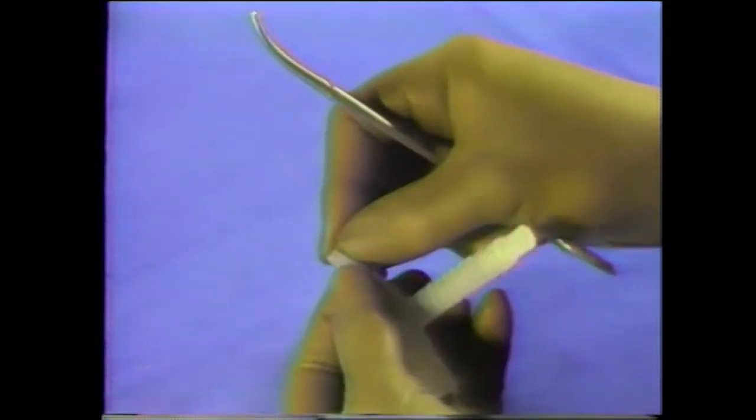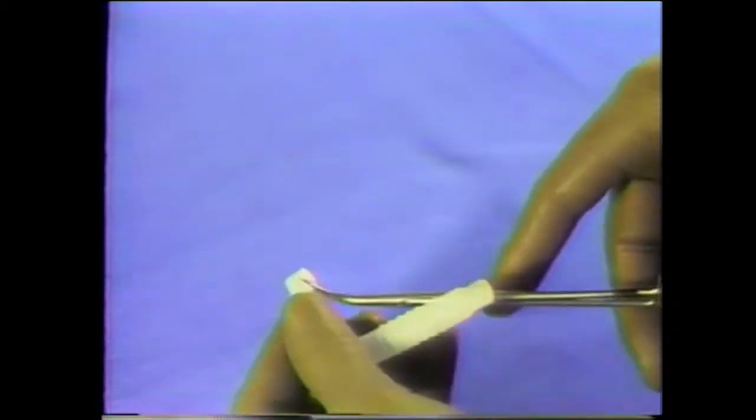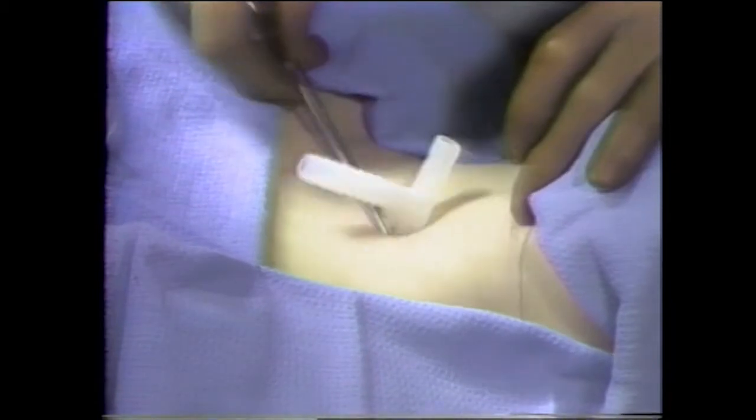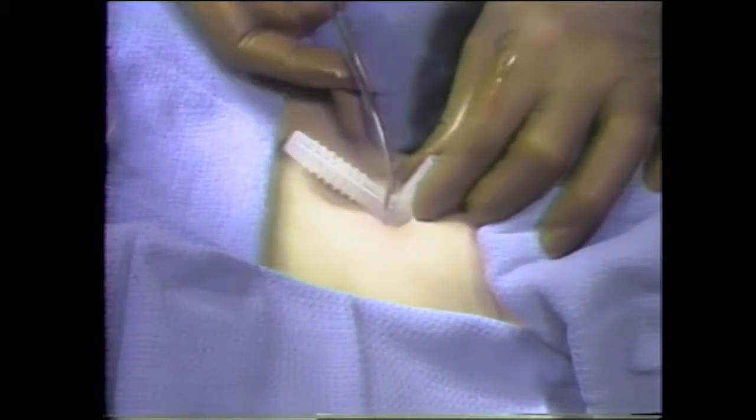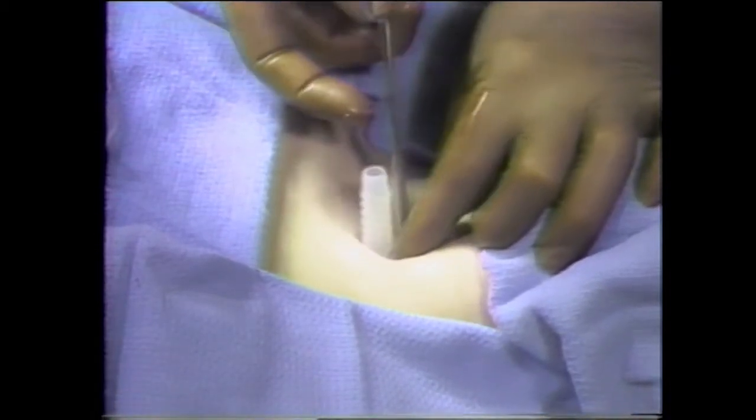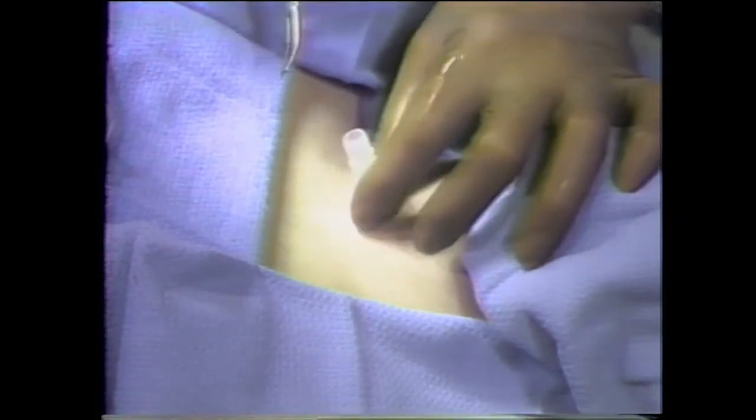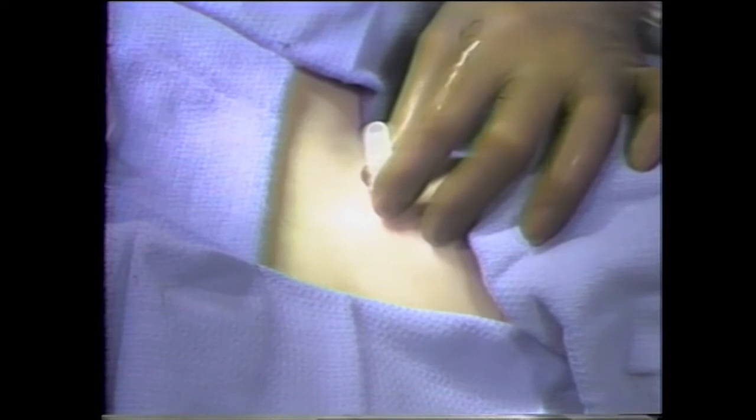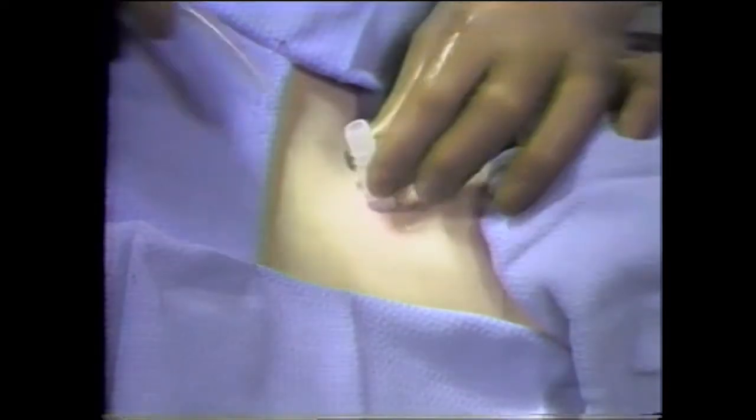The intraluminal portion of the safety tube which is to be directed inferiorly is crimped and grasped with a hemostat. This portion of the safety tube is inserted by way of the tracheotomy. As soon as it is intraluminal the hemostat is released and applied to the opposite intraluminal portion. Once the intraluminal portion is inside the trachea the safety tube is grasped and pulled anteriorly. In so doing the intraluminal portions snap into place.